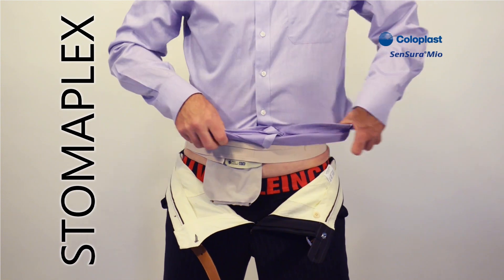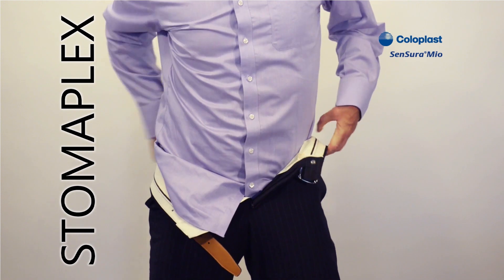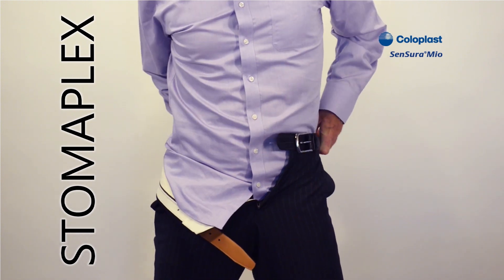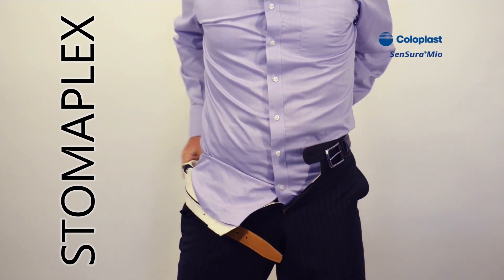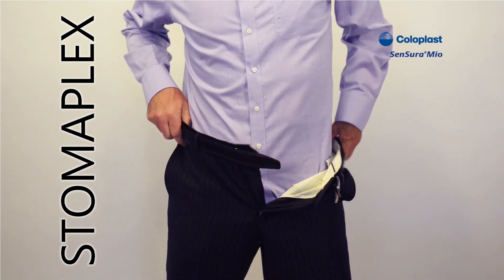Now I'm going to show you how easy it is to finish getting dressed, and tighten your belt directly over the stoma, allowing for the ostomy's output to float unobstructed to the bottom of the bag.